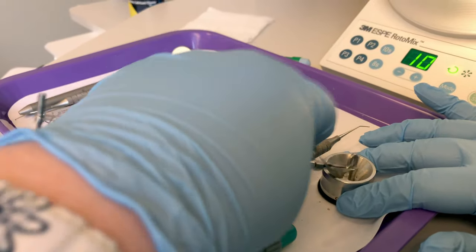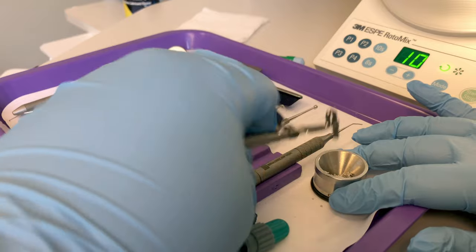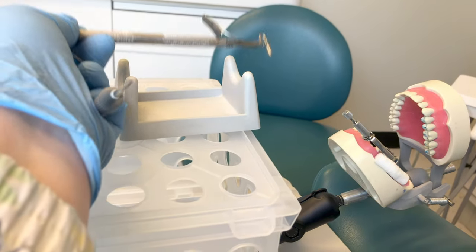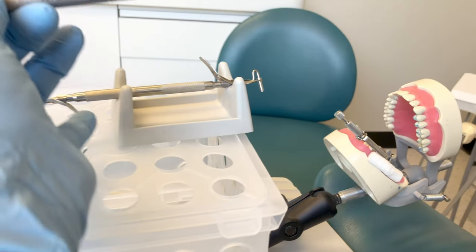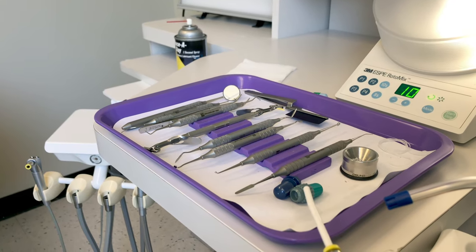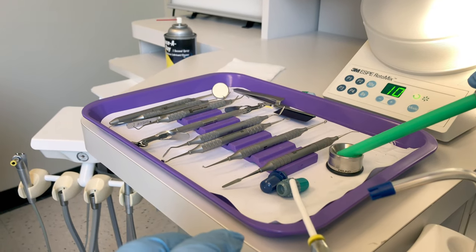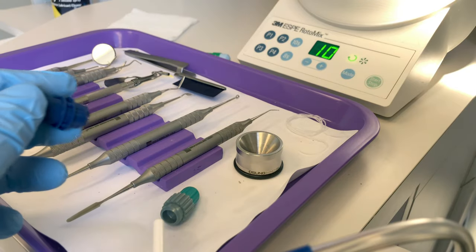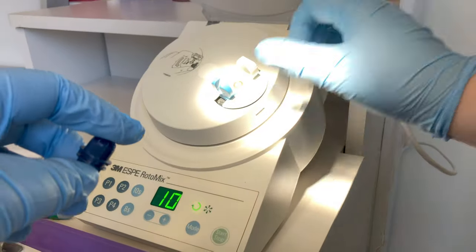Communicate with your operator — let them know if you're getting to the end of your amalgam material. They will let you know if you need to make another mix. Return to the doctor, take the old instrument with your pinky, tuck and deliver. If the doctor signals they need another mixture of amalgam, remove any remaining pieces from your well or squeeze cloth so the old mix does not interfere with the new mix — you'll get two different set times if you combine them.